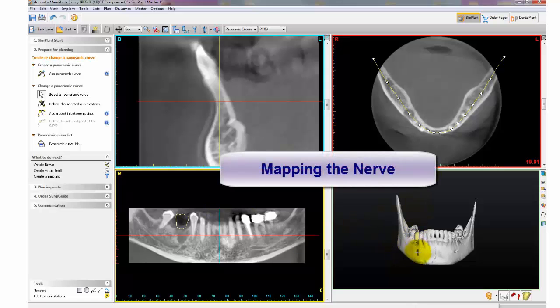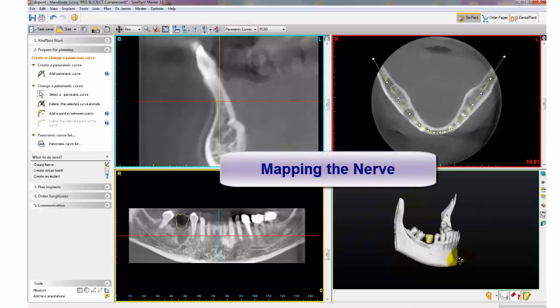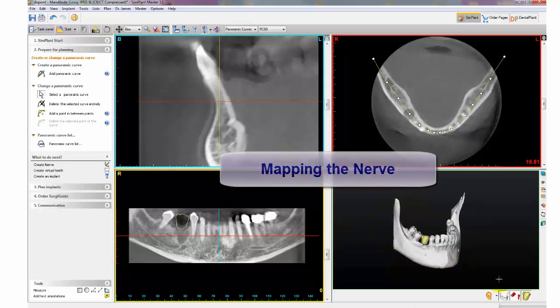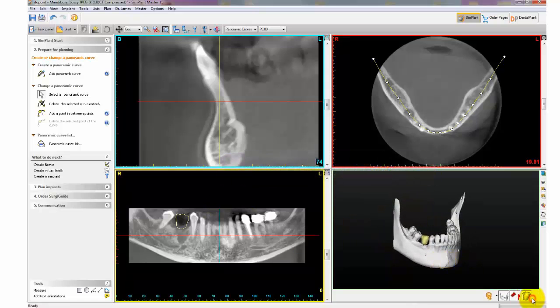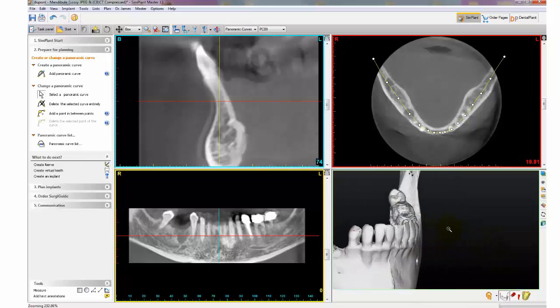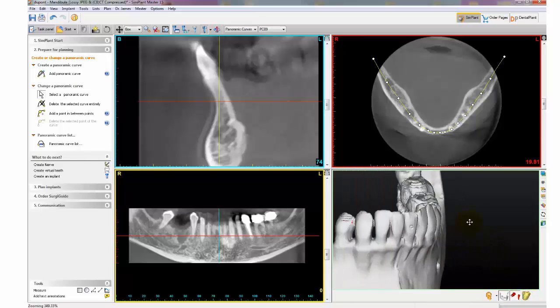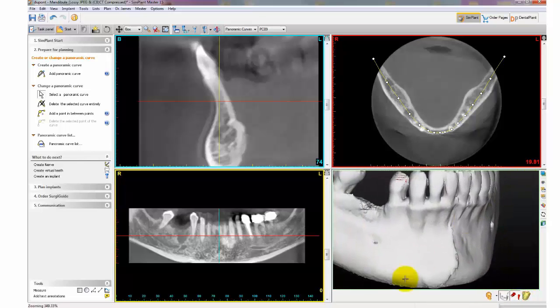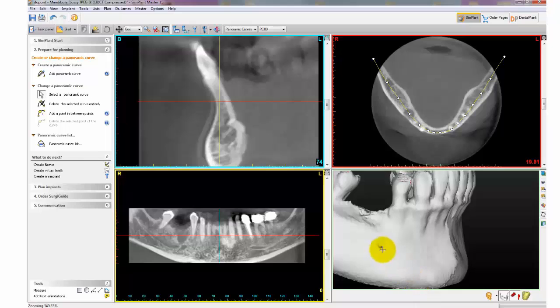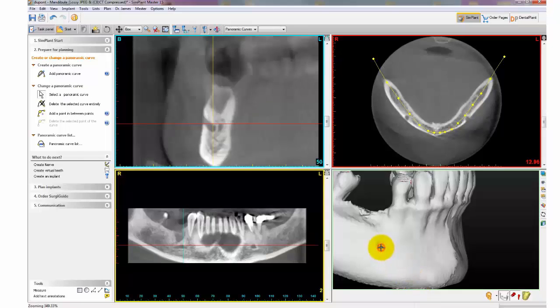Now let's map the nerve. Start off within your 3D view and zoom in until the mental foramen is visible. Click on the mental foramen, which will jump all four views to that specific slice.